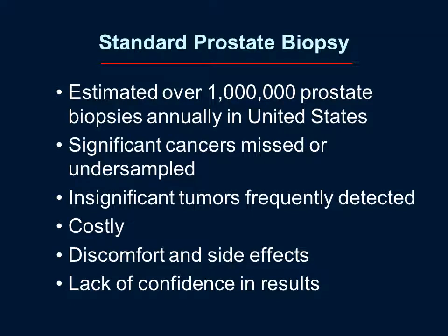So this case illustrates how the value of prostate MRI in large part really stems from it addressing challenges of conventional systematic prostate biopsy. It's estimated that over 1 million prostate biopsies are performed annually in the U.S., and with a traditional biopsy scheme, significant cancers are commonly missed or undersampled, and insignificant tumors are frequently detected.